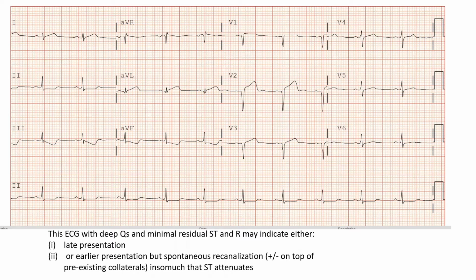Either way, with that EKG, in the absence of persistent chest pain, and if clinically the presentation seems to be more than 24 hours, this EKG does not suggest an absolute need for emergent recanalization. Now, we take the patient emergently, but keep in mind that maybe there is no absolute need for emergent recanalization. That will help you in making downstream decisions as you're doing your coronary angiogram.